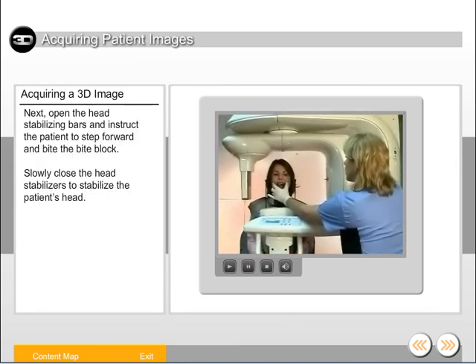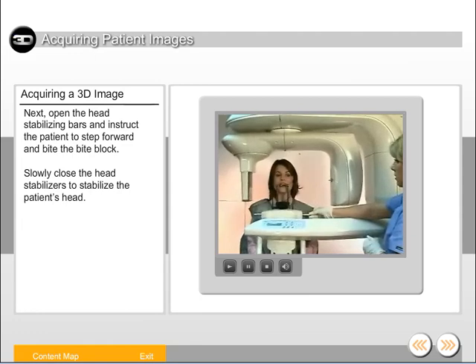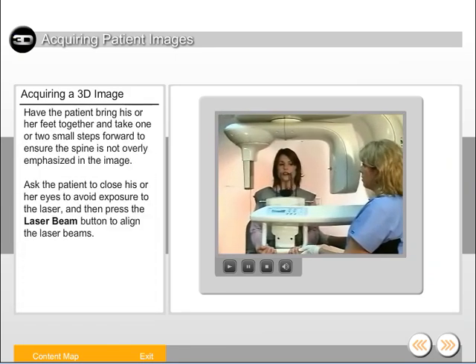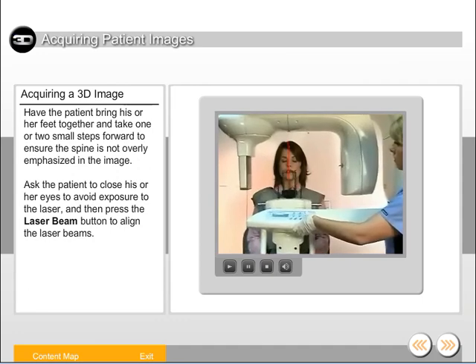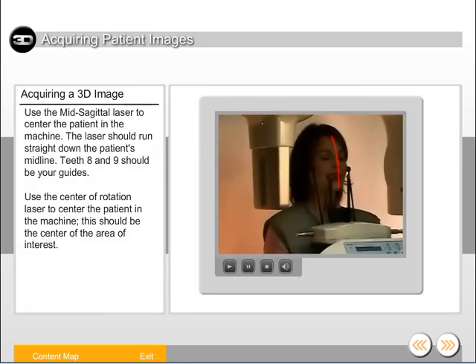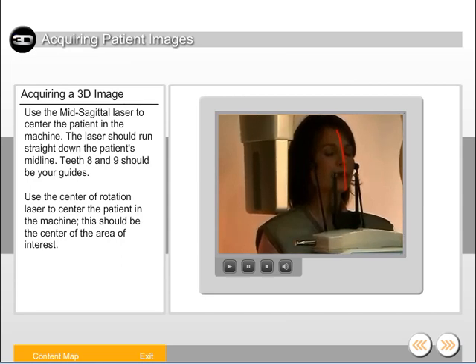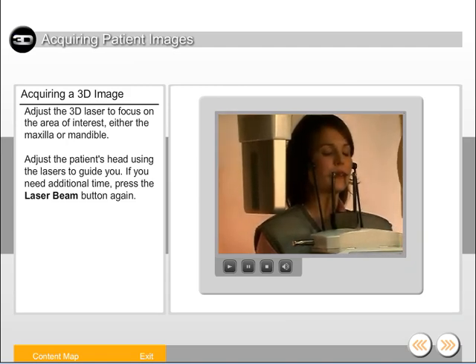Next, open the head stabilizing bars and instruct the patient to step forward and bite the bite block. Slowly close the head stabilizers to stabilize the patient's head. Have the patient bring his or her feet together and take one or two small steps forward to ensure the spine is not overly emphasized in the image. Ask the patient to close his or her eyes to avoid exposure to the laser, then press the laser beam button to align the laser beams. Use the mid-sagittal laser to center the patient in the machine — the laser should run straight down the patient's midline. Teeth 8 and 9 should be your guides. Use the center of rotation laser to center the patient in the machine; this should be the center of the area of interest. Adjust the 3D laser to focus on the area of interest, either the maxilla or mandible.